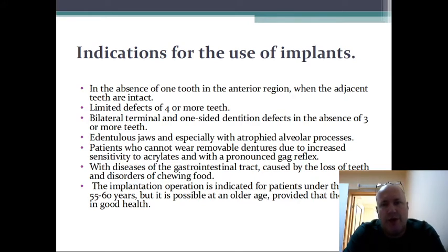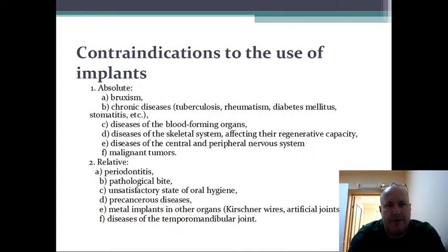Patients who cannot wear removable dentures due to increased sensitivity to acrylates and with a pronounced gag reflex. With diseases of the gastrointestinal tract caused by the loss of teeth and disorders of chewing food. The implantation operation is indicated for patients under the age of 55 or 60 years, but it's also possible at an older age, provided that they're in good health.